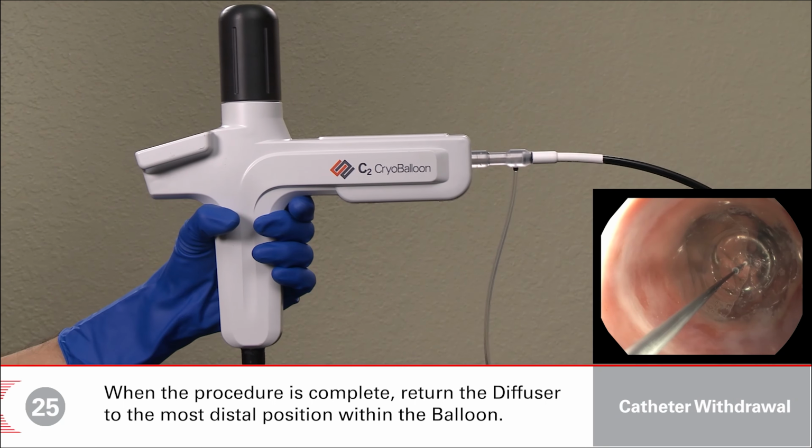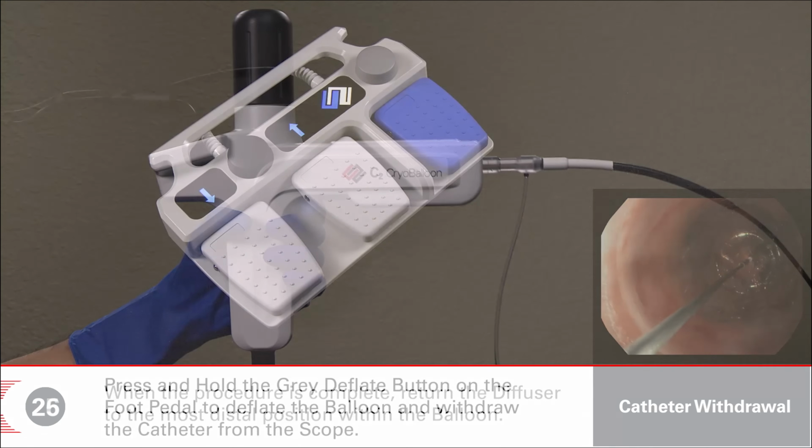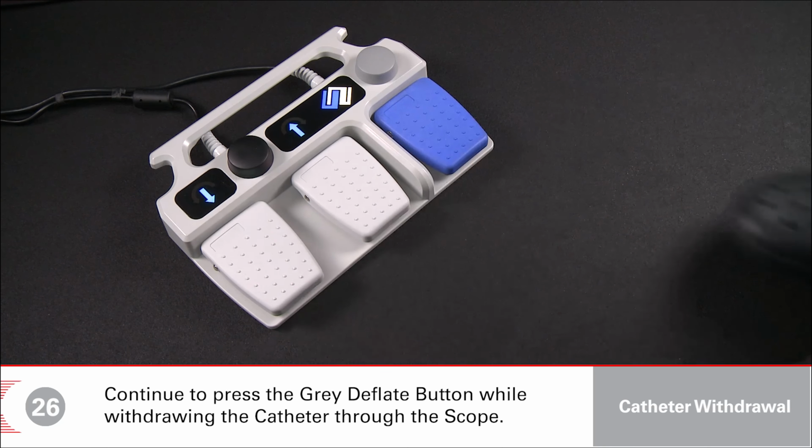When the procedure is complete, return the diffuser to the most distal position within the balloon. Press and hold the gray Deflate button on the foot pedal to deflate the balloon and withdraw the catheter from the scope. Continue to press the gray Deflate button while withdrawing the catheter through the scope.